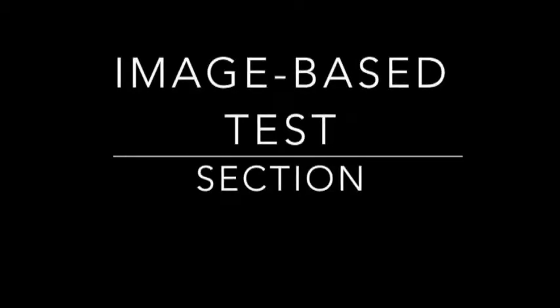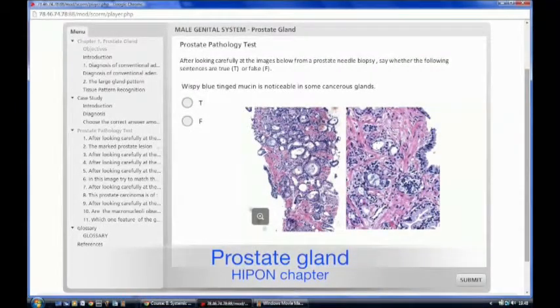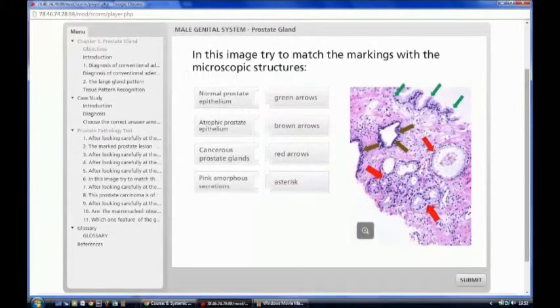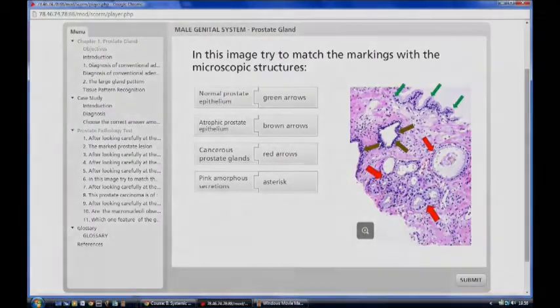Then, in the image-based test section, the user's acquired diagnostic experience can be estimated by answering single-answer or multiple-choice image-based questions, as well as by matching the microscopic features shown in images with the relevant morphological terms.